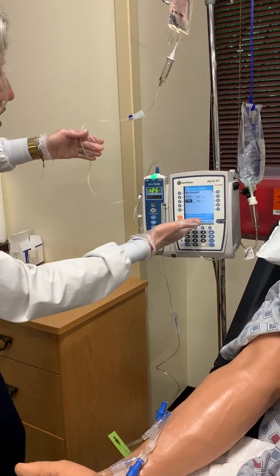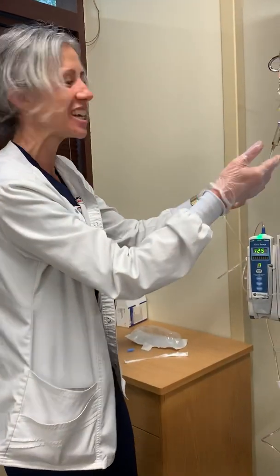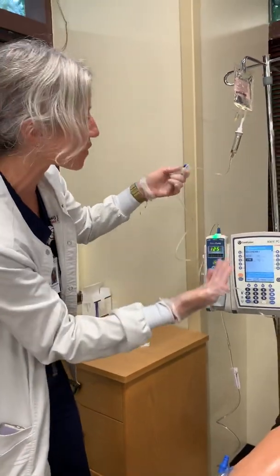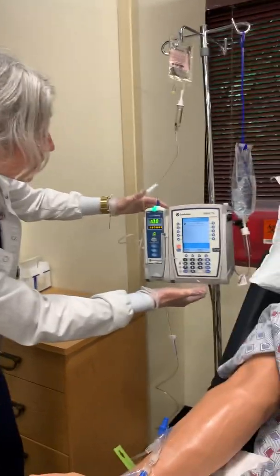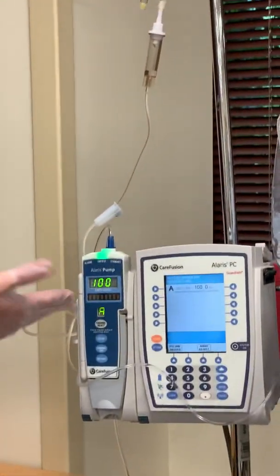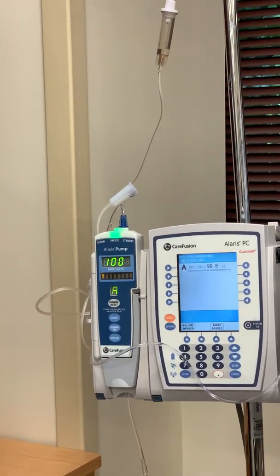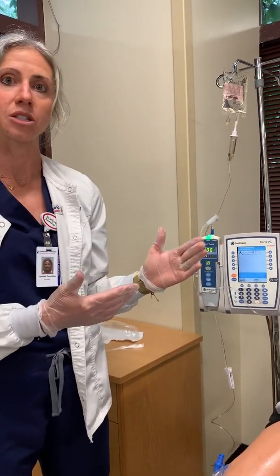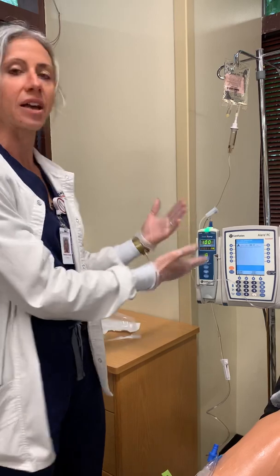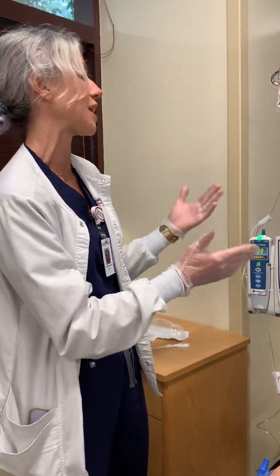So we've got everything set up. It's gonna tell you what to do. Verify the secondary clamp is open. Oh, thank you for reminding me it's not open, right? So read this, the machine tells you what to do. Okay, so verify that's open, and then I'm gonna hit start, okay? Now here's the big thing. When you start it, this little lovely thing is gonna tell you what's happening, okay? In the hospital, when you actually scan a drug or you manually put in the drug, it tells you what's going through, okay? So that's a beautiful safety measure. It'll say vancomycin, or it'll say azithromycin, or whatever's going through, it's gonna tell you what's actually running, okay?